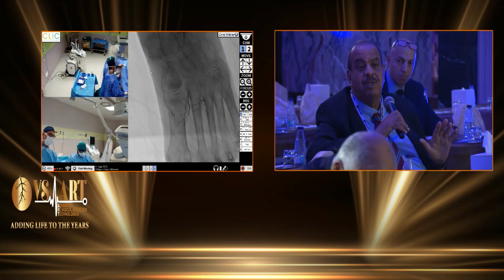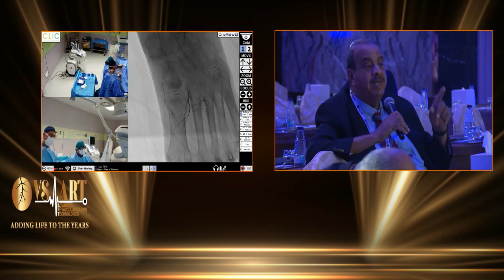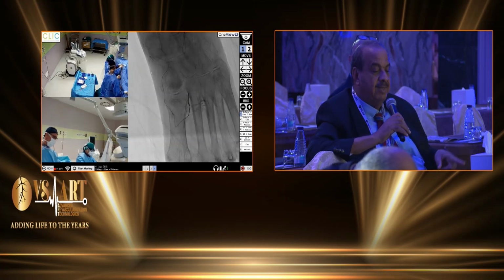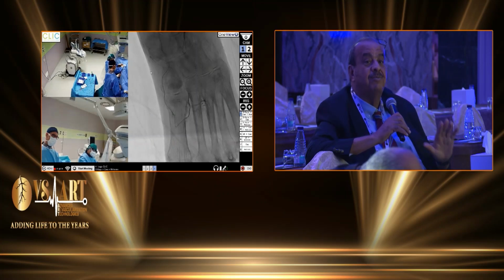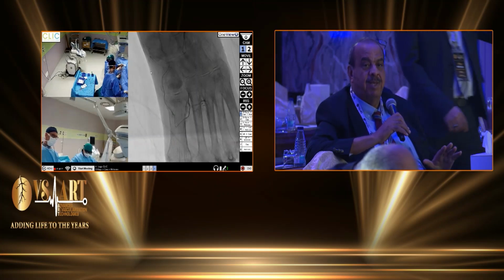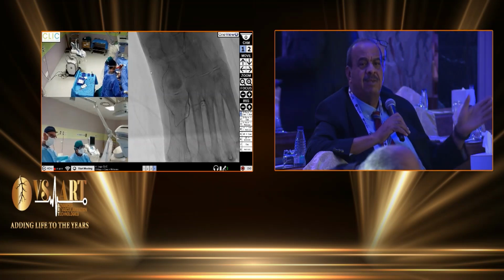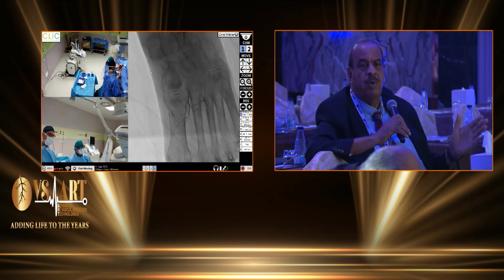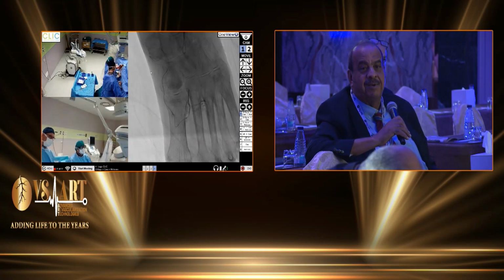And we are not going to treat morphology of the arteries. Usually, if one is passing good and the circulation in the foot is okay from the collaterals, this will save the patient from the critical limb ischemia. And usually we try 1, no need for the 3. Just 1 or 2 is quite enough. We are not going to let him be a runner.